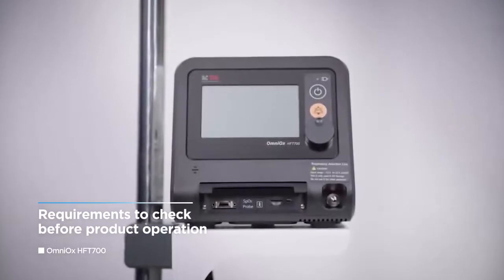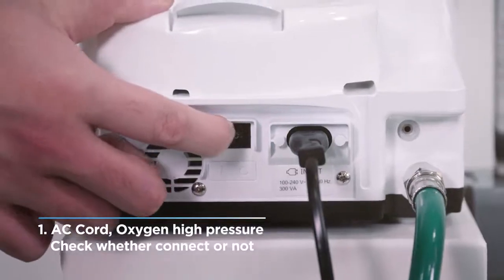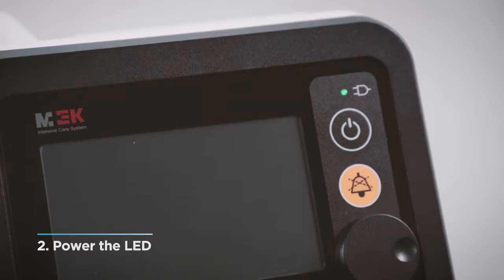Before operating the Omniox HFT700, check that the following has been done. Make sure the power cable and oxygen high pressure hose are connected to the device and power switches are turned on at the rear side. The AC power LED will turn green when the device is ready to be powered on.